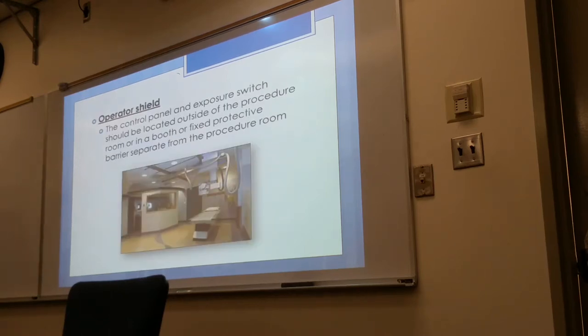Operator shield, the control panel, and exposure switch should be located outside of the procedure room or in a booth or fixed protective barrier separate from the procedure room. That's it.